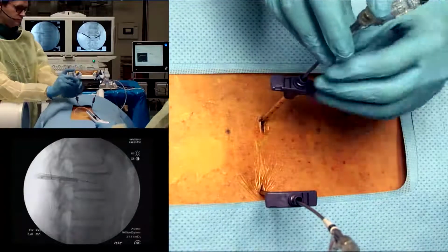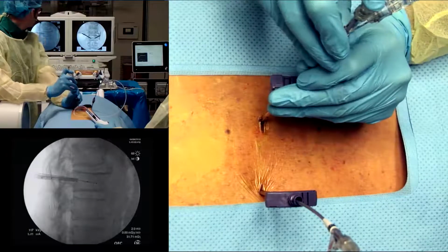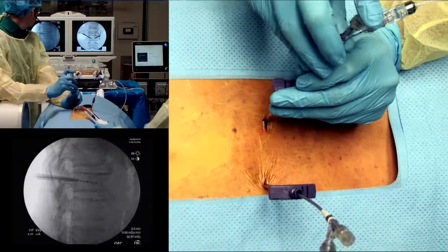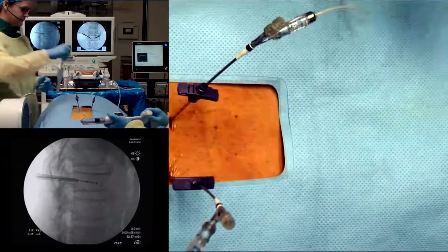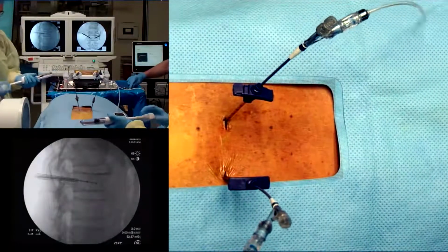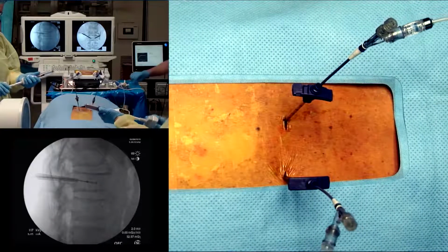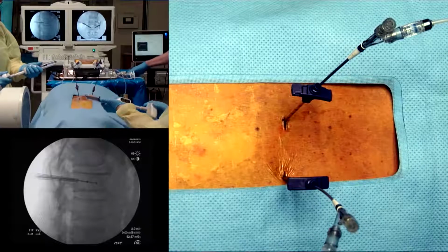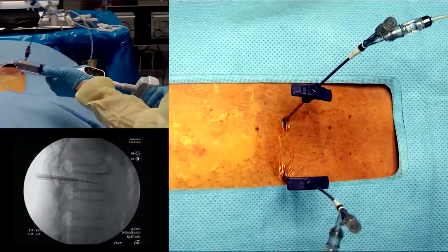So Zane's going to actually put his in the same place as well. If it's not advancing, we could always recannulate. That looks pretty good. And so now what we're going to do is we're going to both sequentially start twisting this, and we can see how much volume we're actually delivering to the vertebral body through the balloons.